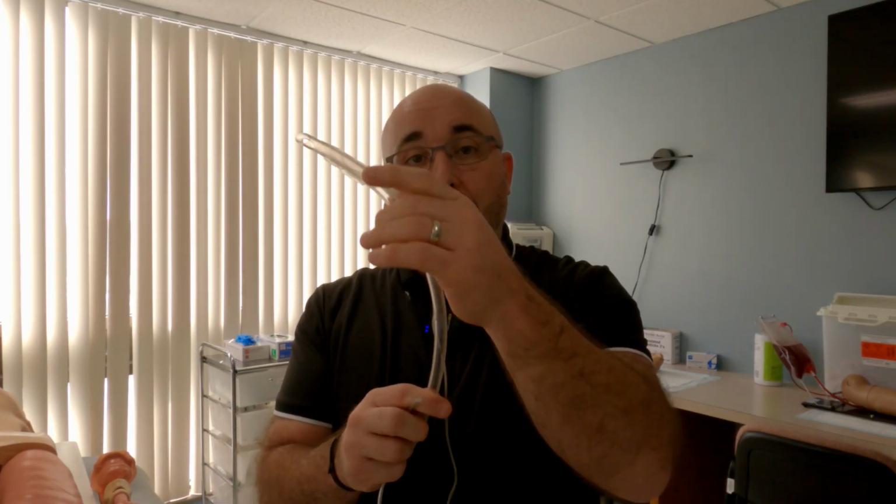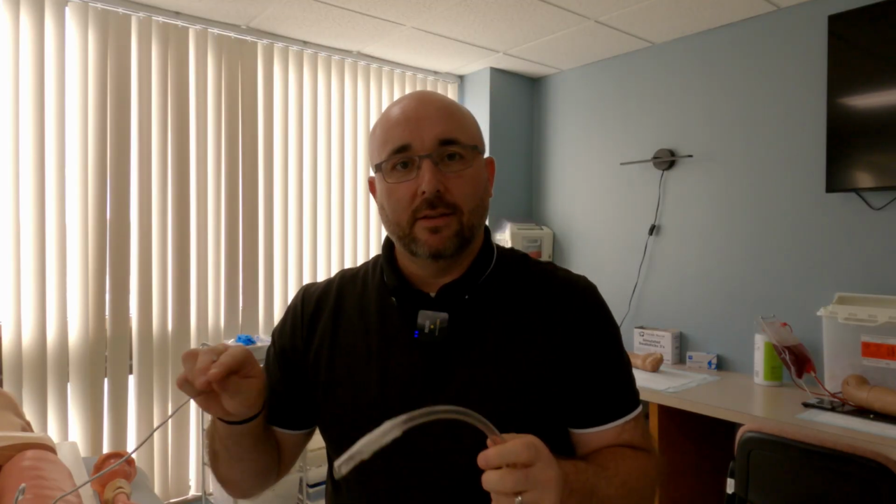So this comes out of a package. It's sterile. Okay, I'll take that off of it for now.